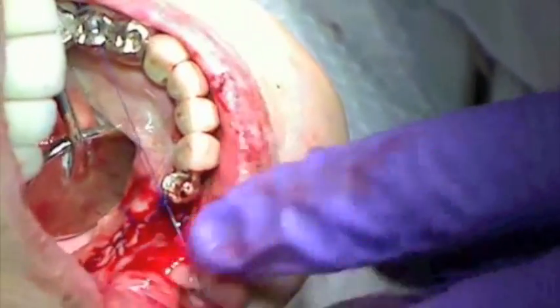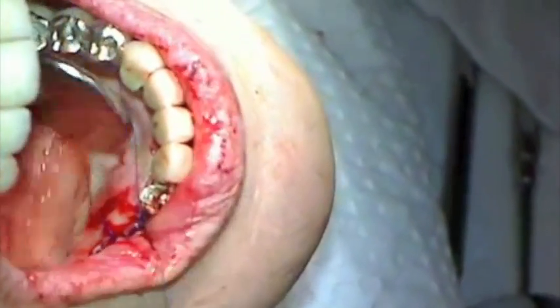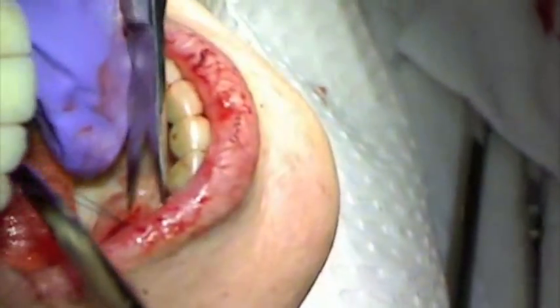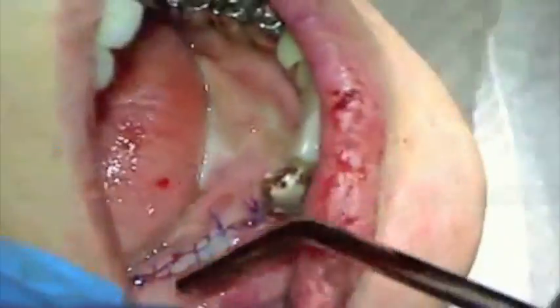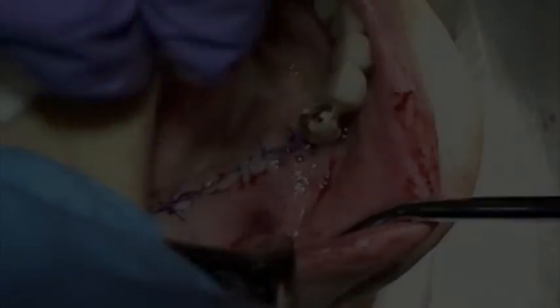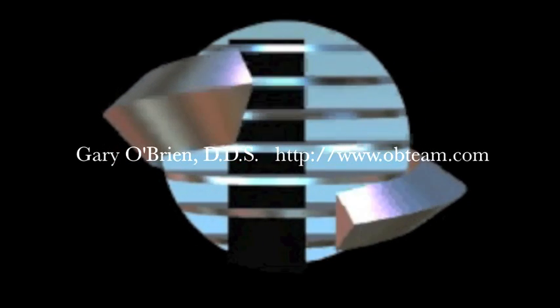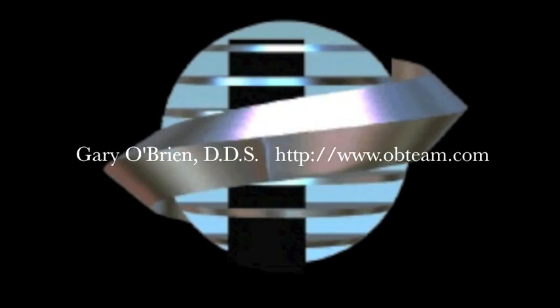After the final suture is placed, the area will be cleaned and evaluated for good primary closure. This video is part of an educational series developed to help doctors in treatment planning and diagnosis, surgical placement, and restoration of dental implants.